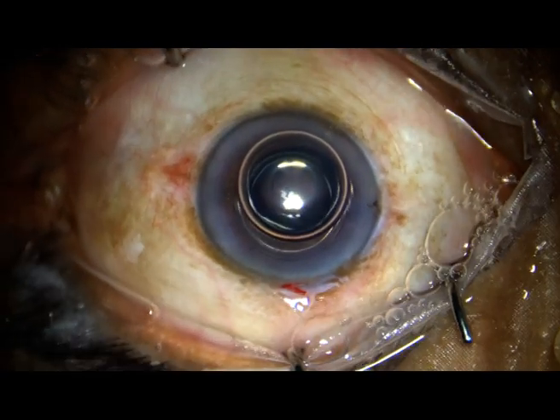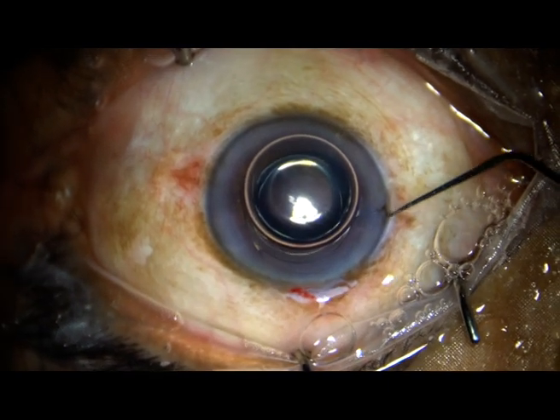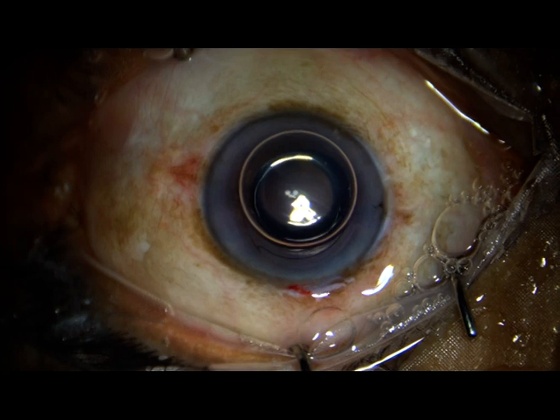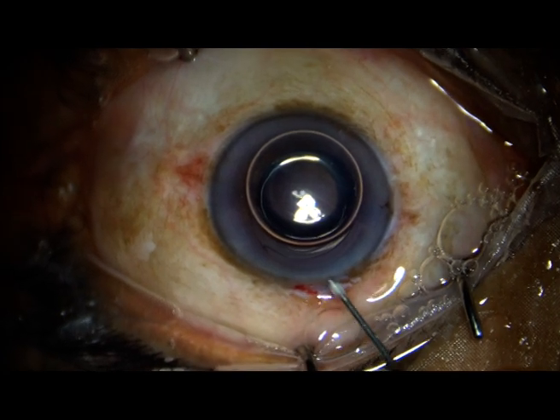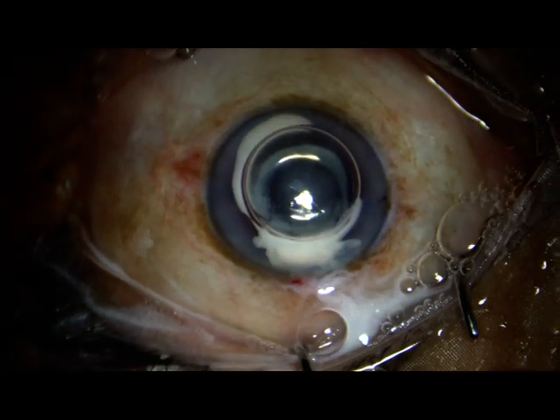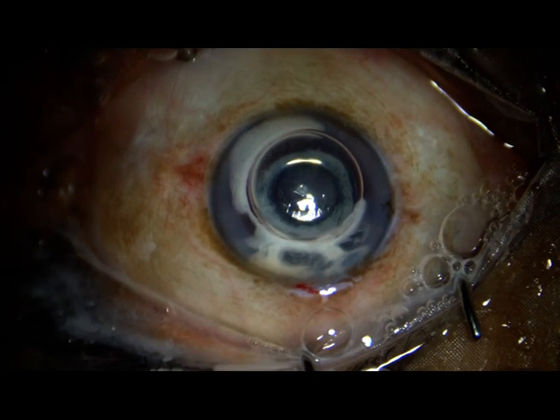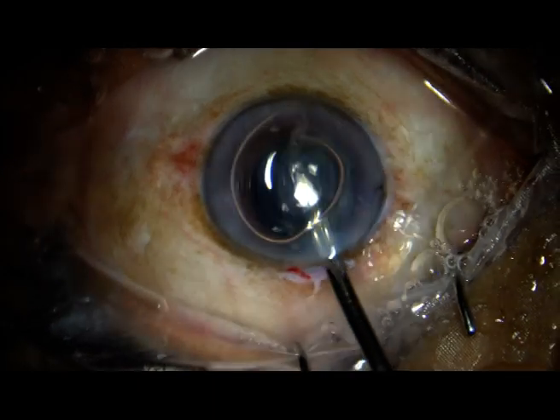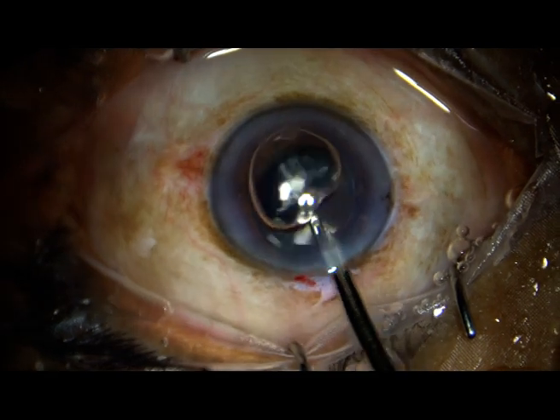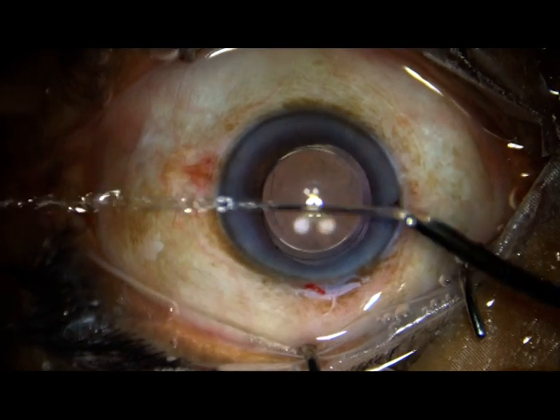...I am quite sure there is no vitreous in the anterior chamber. This is one more test to check if anything is there. And now this is triamcinolone acetonide, just to confirm that there is nothing in the anterior chamber — no vitreous strands. And as expected, there was no vitreous in the anterior chamber.